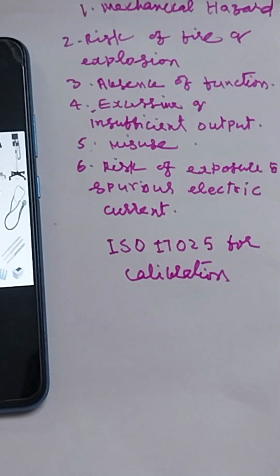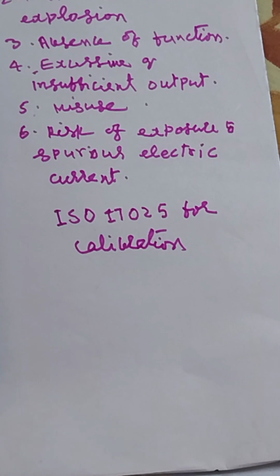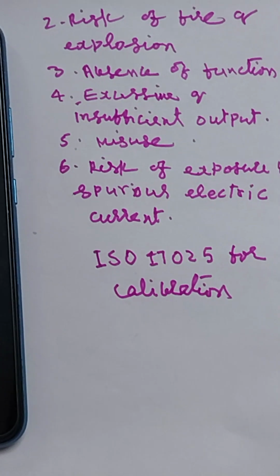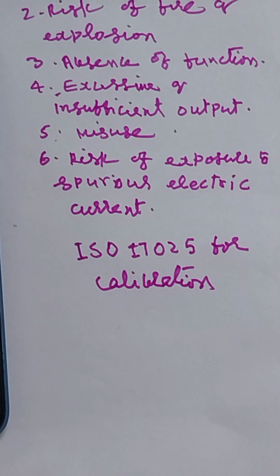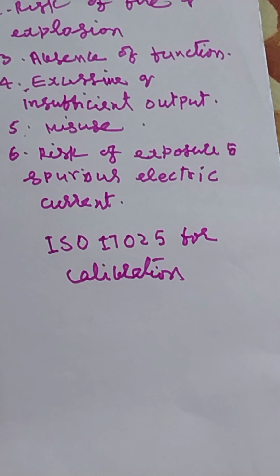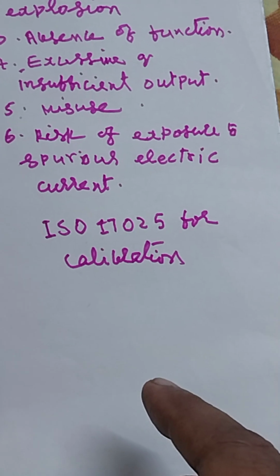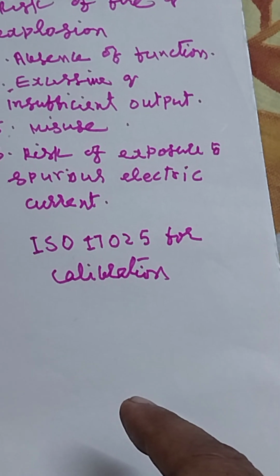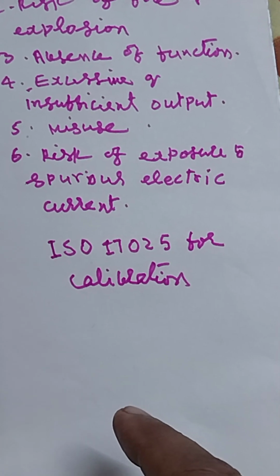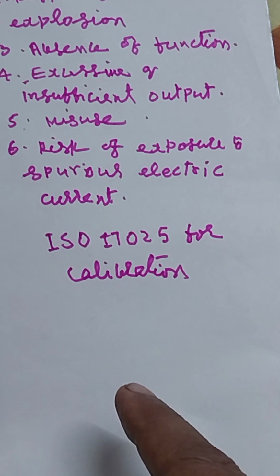Calibration certificates are valid for 1 year, after which you need to calibrate in order to maintain accuracy. A calibration certificate should contain the name and contact information of the laboratory that performed the calibration and contact information of the person who requested the calibration. The certificate should also include the date of calibration, the equipment used, measurements taken, and uncertainties associated with those measurements.